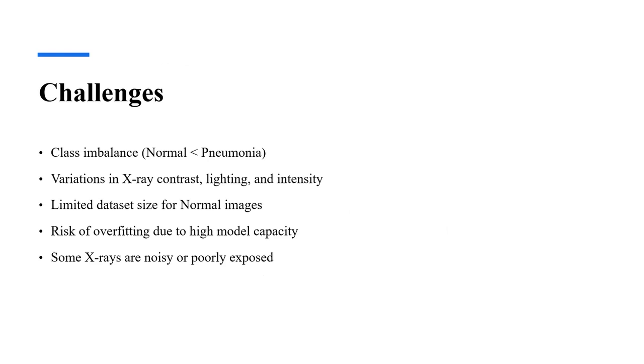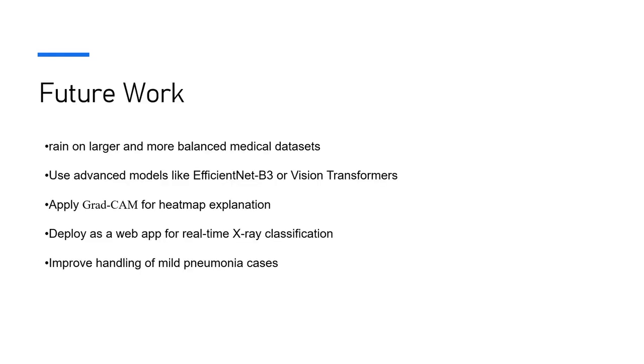We faced several challenges during this project. There was a class imbalance with fewer normal images compared to pneumonia. Many X-ray images had variations in lighting and contrast. Some images were noisy and the deep model was prone to overfitting. We addressed these using augmentation and regularization.